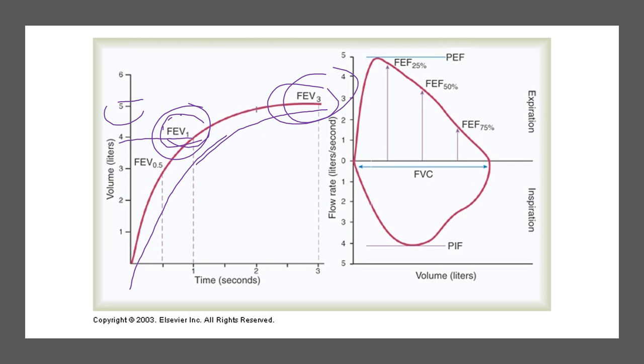The graph on the right over here. This one's a little bit different. This is a flow volume loop. This is even on mechanical ventilators. You can see this on vented patients, which is a great advantage for your obstructive patients that are on the ventilator. You got someone with severe COPD on the ventilator, severe asthma on the ventilator. The flow volume loop can be very helpful, especially now that you'll know what it means.